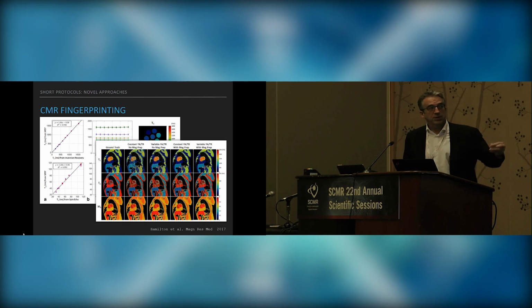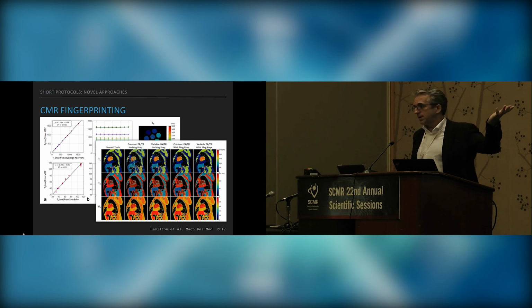And so in the future, it may be possible to do this in 20 minutes if you want to use perfusion, or in non-ischemic disease, maybe even in 10 minutes. And that is, of course, a totally different ball game.